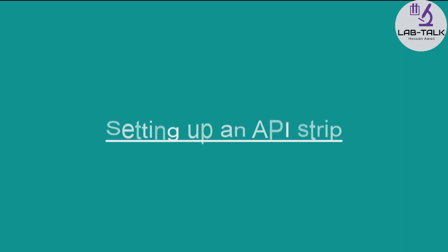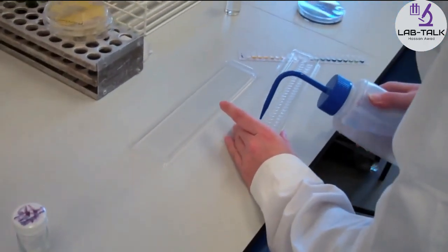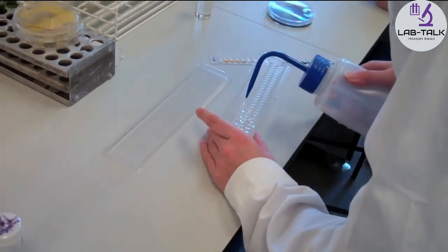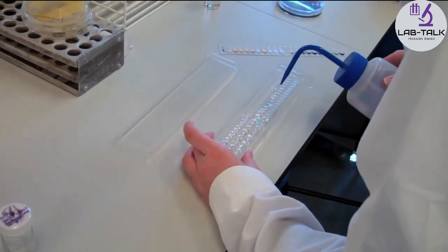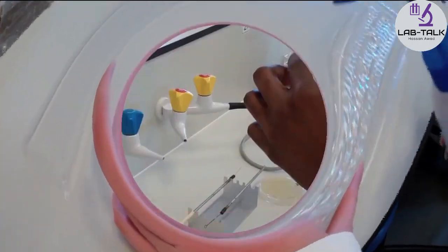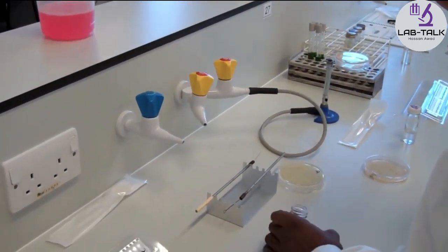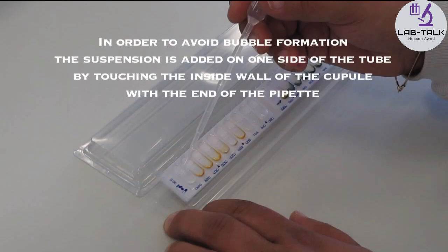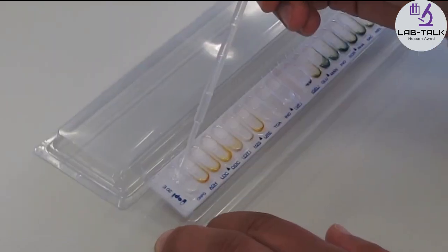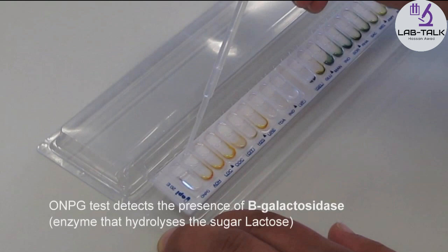Setting up an API strip. The bottom of the tray of the API strip holder is filled with sterile water in order to prevent dehydration of the strip during the incubation time. A Pasteur pipette is used to inoculate the strip with bacterial suspension. Each of the tubes on the API strip is filled with bacterial suspension from left to right.